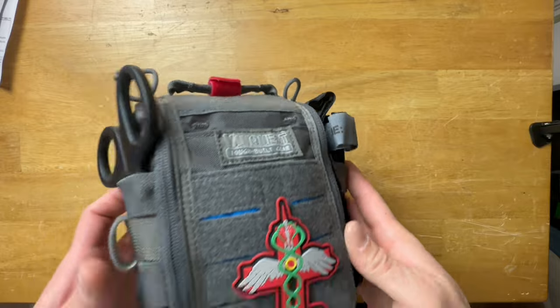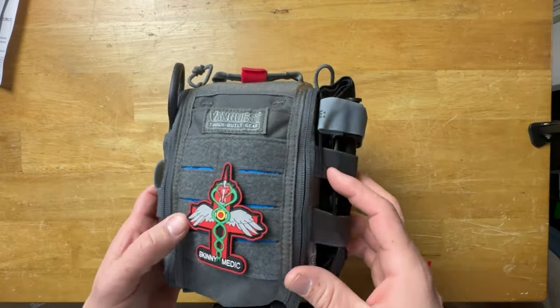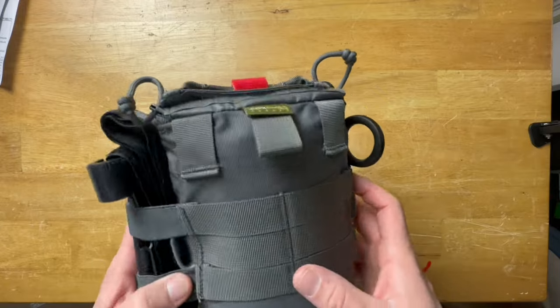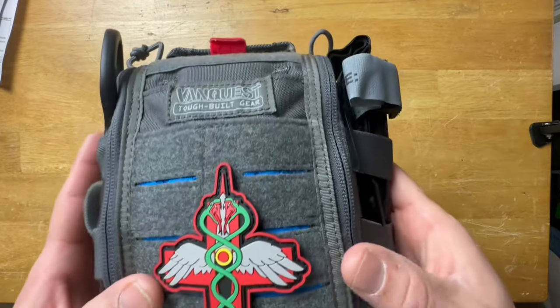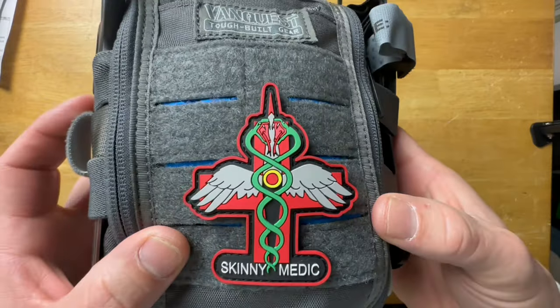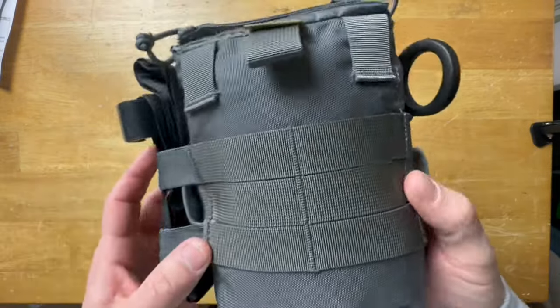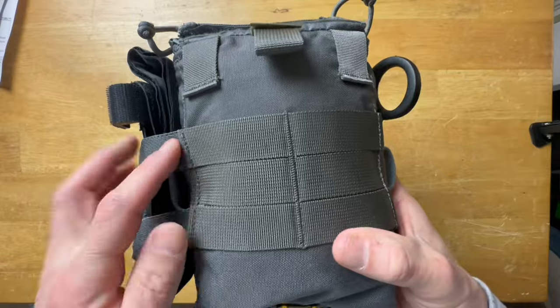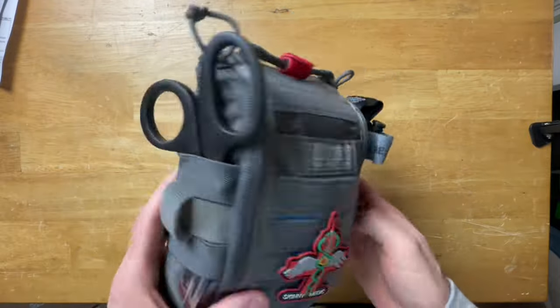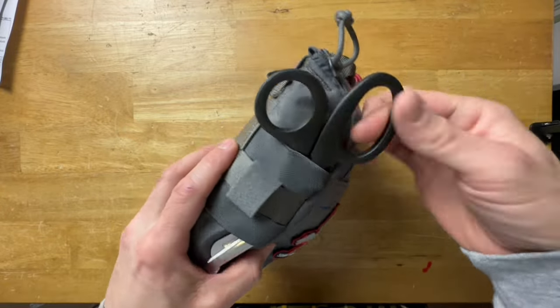The bag itself is very high quality — it's made by Van Quest. Very high quality bags. Available in four different colors if you don't like the gray. There's a bunch of velcro on the front and it comes with a cool Skinny Medic patch — by far my favorite part of this bag. There's also MOLLE on it if you want to hang accessories or mount it to a bag or a MOLLE panel.